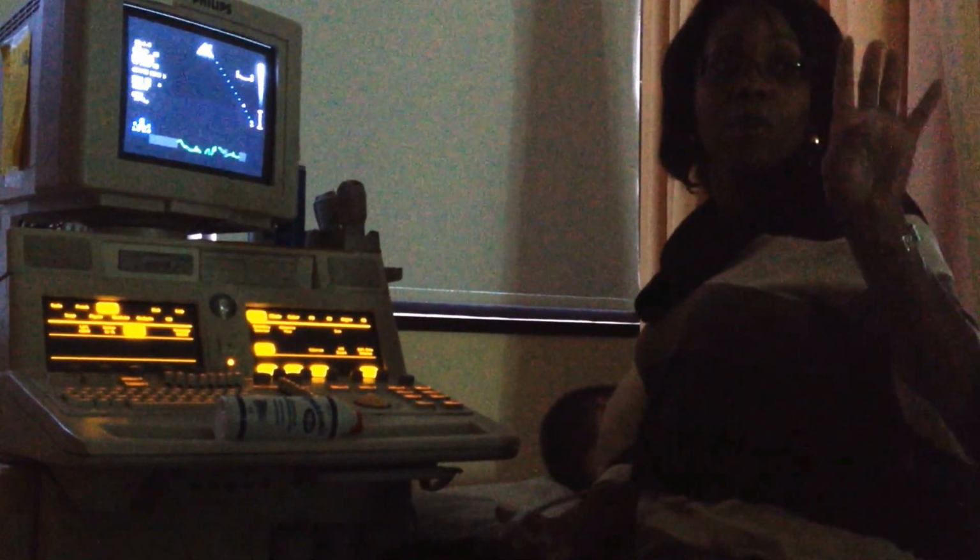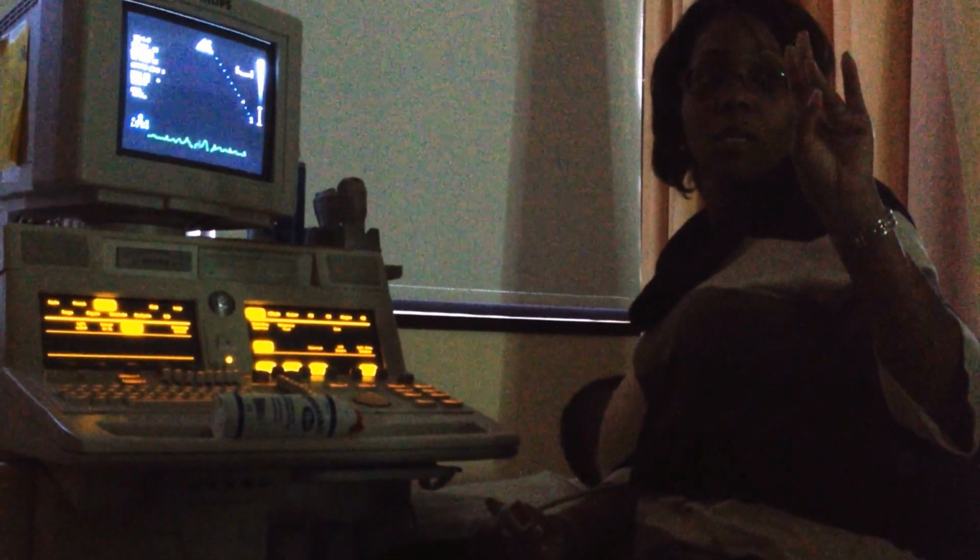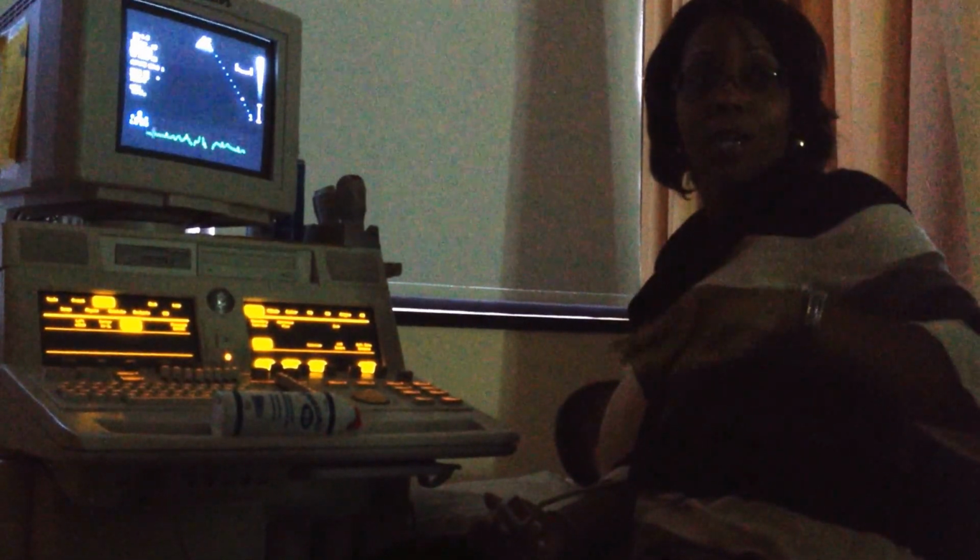Question, so you have 4 views for your parasternal, right? Parasternal long, RVIT, RVOT, parasternal short at 3 different levels. 4 if you can get down to the apex. Okay? Do you want me to show you apicals this week or wait till next week?